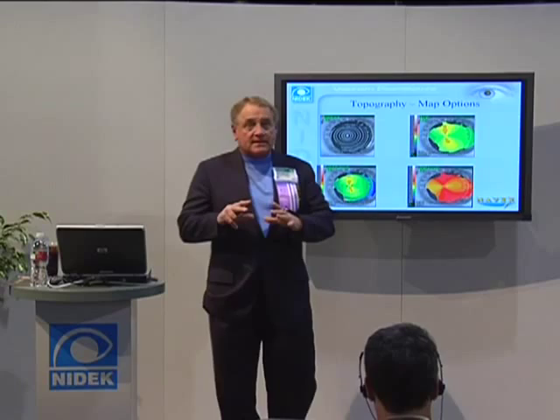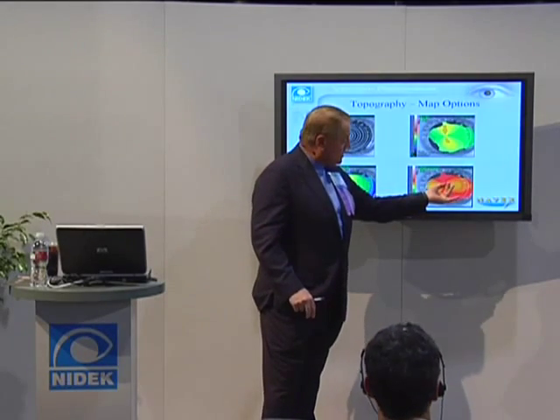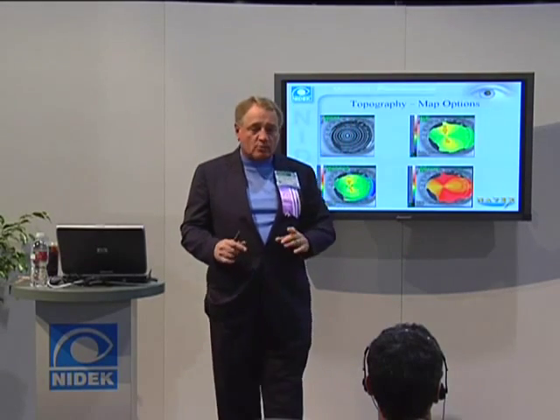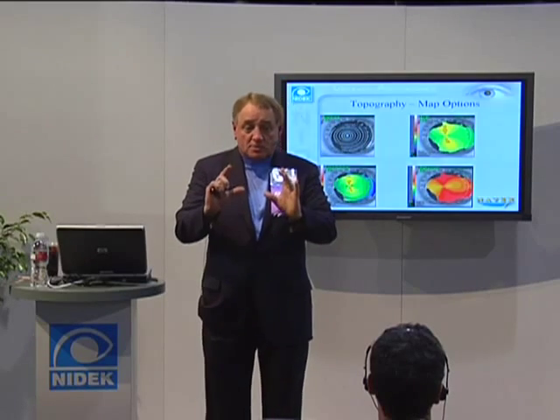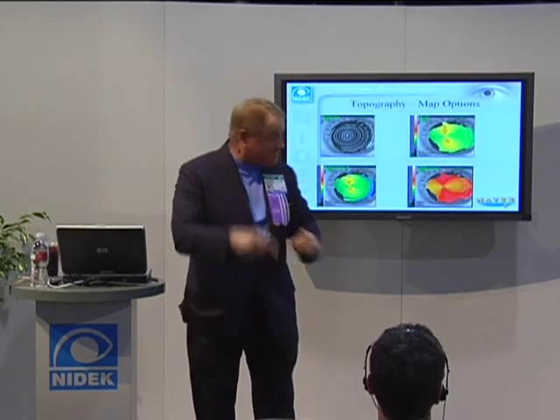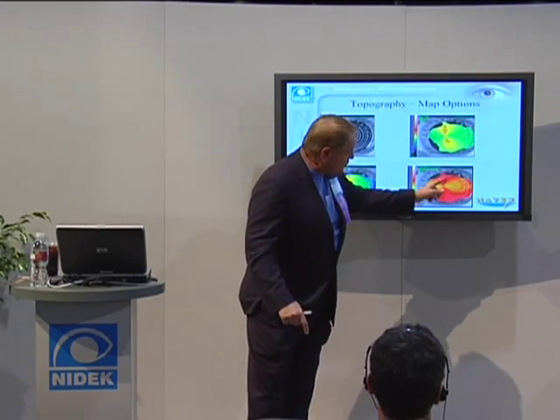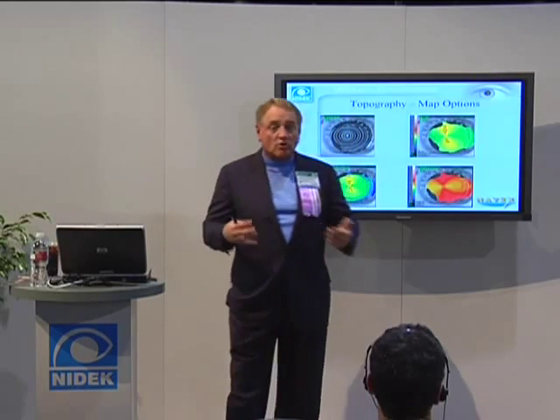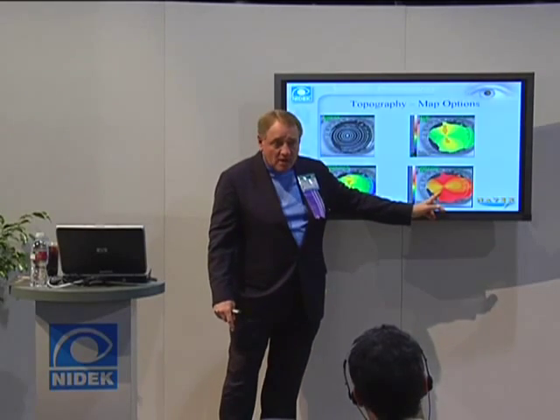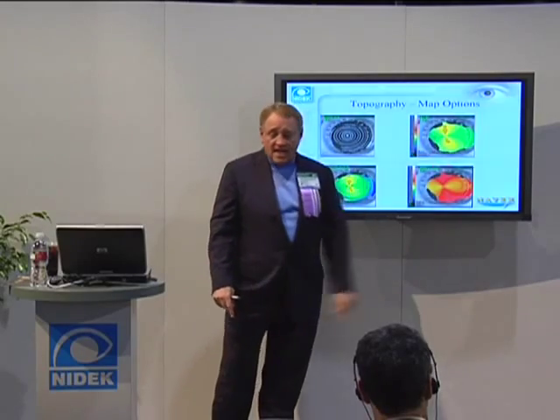If we want to treat that from the standpoint of the patient having a pupil that has moved up a little bit, we'd know exactly how much power change there would be for somebody who had an updrawn pupil from cataract surgery. We know what their refractive shift could be from here to right there. If your pupil were right here, you wouldn't have any astigmatism, but you'd be stronger in power. You can't pick that up here. So the refractive map shows you power changes, shape changes, and the axial map.